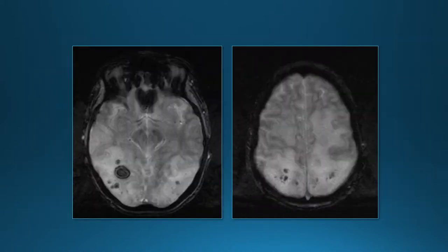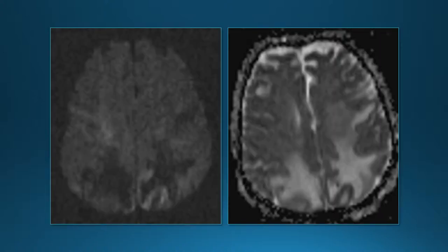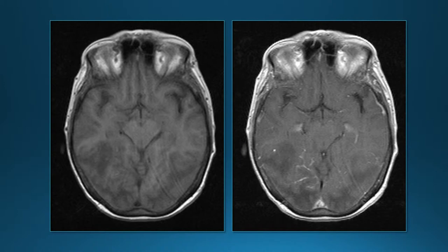Gradient echo images show scattered areas of hemorrhage. Diffusion-weighted images show that most of the abnormality has increased diffusion, although there's a little bit of restricted diffusion in the cortex. On pre- and post-contrast images, there is a little bit of linear enhancement, but not very much.